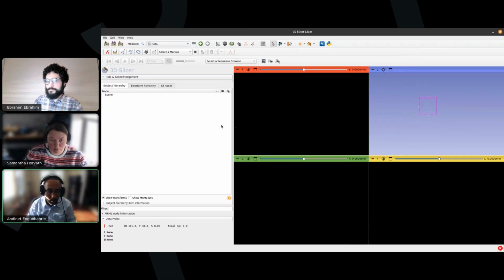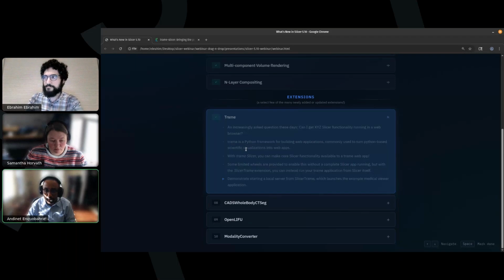Hey Ebrahim, another question came in. Can you talk about the advantages and disadvantages of the Trame Slicer way of porting applications to the web versus running the whole 3D Slicer within a cloud infrastructure like AWS AppStream? Yeah, this is a great question.